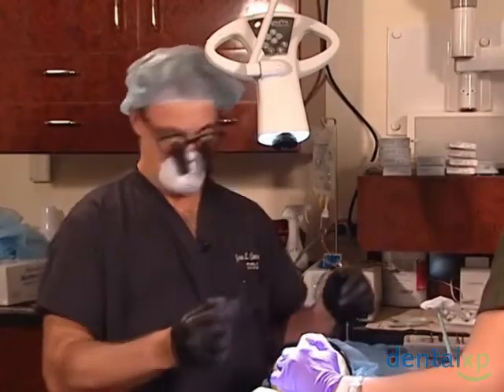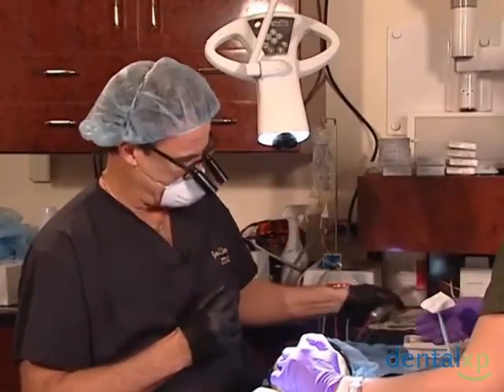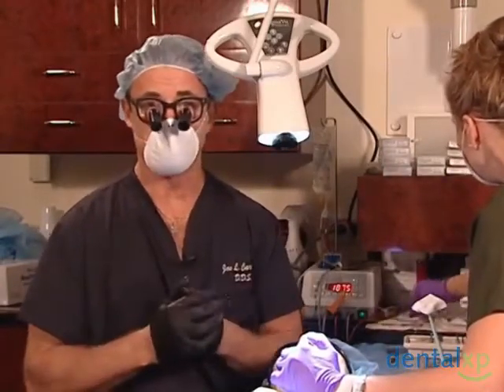So you look back on your sheet to verify. It's always good to have more than one eye reading that. So I read it, the assistants read it, it's red, green, or blue, so we're all in agreement that's what we want, because if I go with the wrong size burr, I've oversized my osteotomy simply because I didn't pay attention. Someone there, it's a double check. What happens if it's too big? Well, you either place a larger implant or move your osteotomy one way or another.